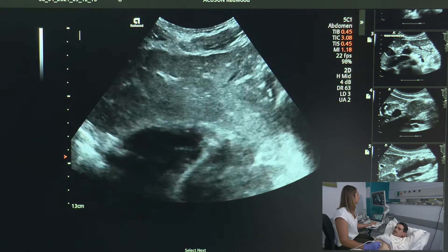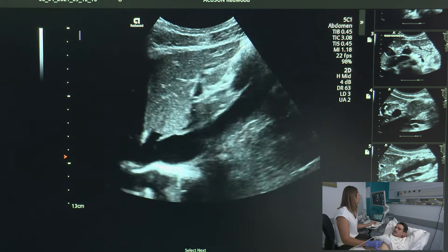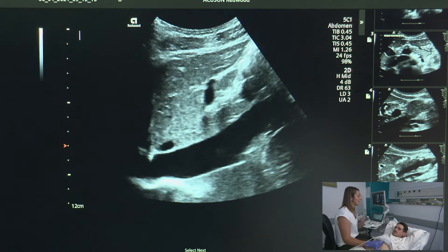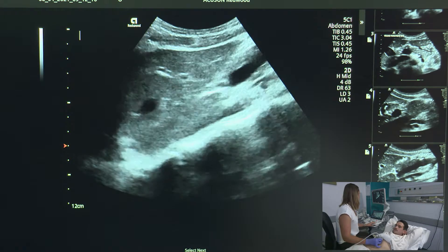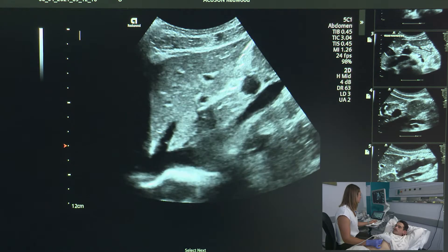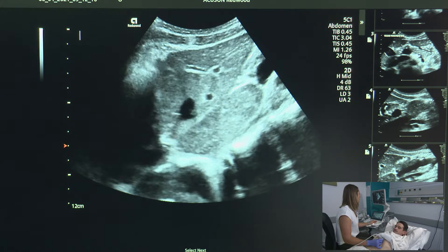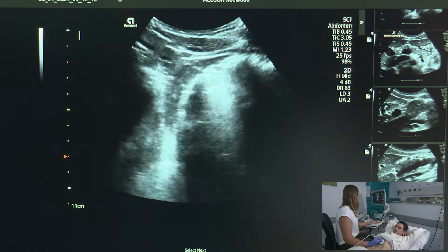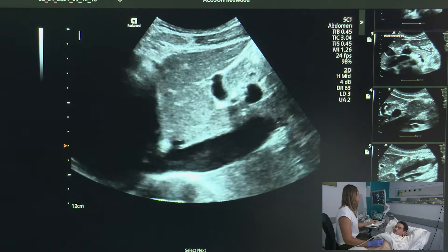Now I can be quite confident that I've seen the entire left lobe in transverse, and I'm going to do the exact same thing but now in the longitudinal plane. I'm going to use the IVC — the inferior vena cava — as my landmark for where I start my scan. I'm also going to make sure that I have the superior border of the left lobe, meaning I'm including the diaphragm the entire time. If you see dropout at the top of the screen, you either need to increase your pressure or add more gel. Big breath in and hold — I sweep keeping the superior border, not so worried if I cut off the inferior border of the left lobe, and I go all the way back to the inferior vena cava. Breathe.